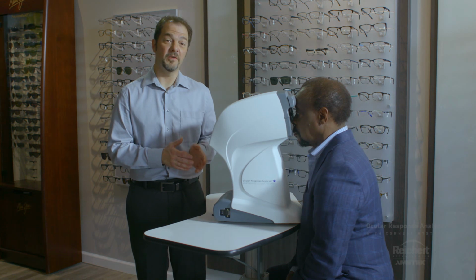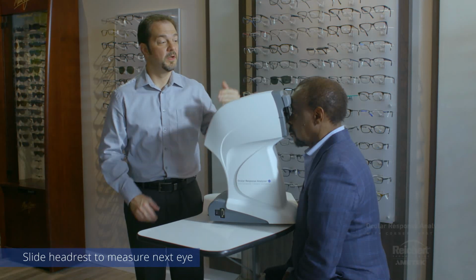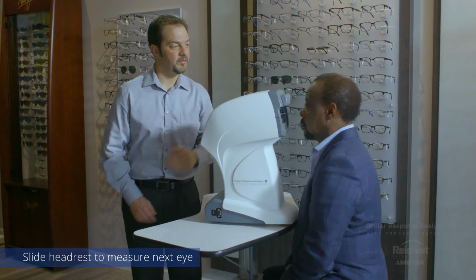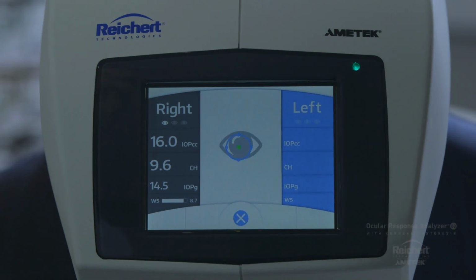After you've completed the first measurement, when you're ready to measure the other eye, you simply slide the forehead rest over and repeat the process. I'm going to ask you to back up just 1 second here. Pull that over and then bring your head straight back forward again like before. Blink a few times for me, keep both eyes wide open, and look at that green light again.